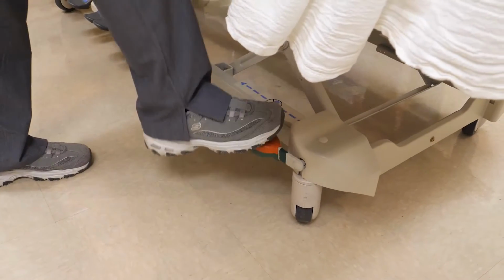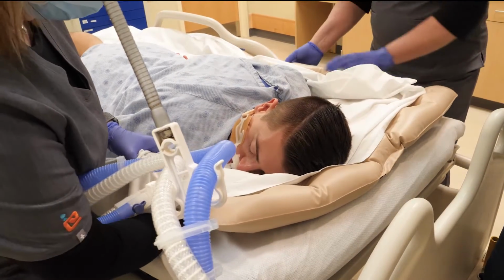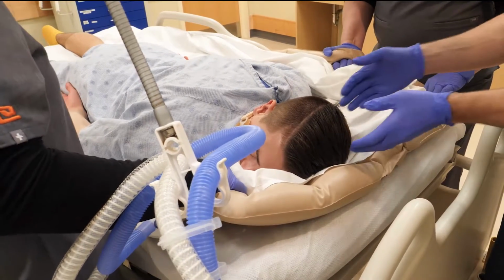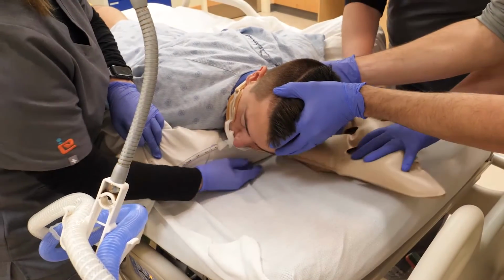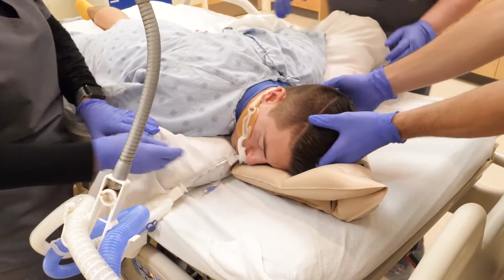First, lock the wheels and lower the bed rails to remove the Waffle overlay straps at the head of bed. While one caregiver maintains the proper position of the patient head and neck, two caregivers grasp the top corners of the overlay and gently fold it underneath. A folded Waffle cushion is placed underneath the patient's head to provide pressure redistribution and help prevent facial pressure injuries.